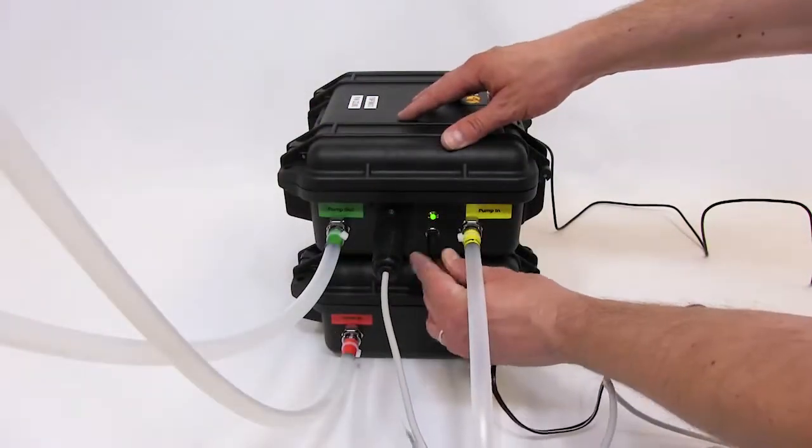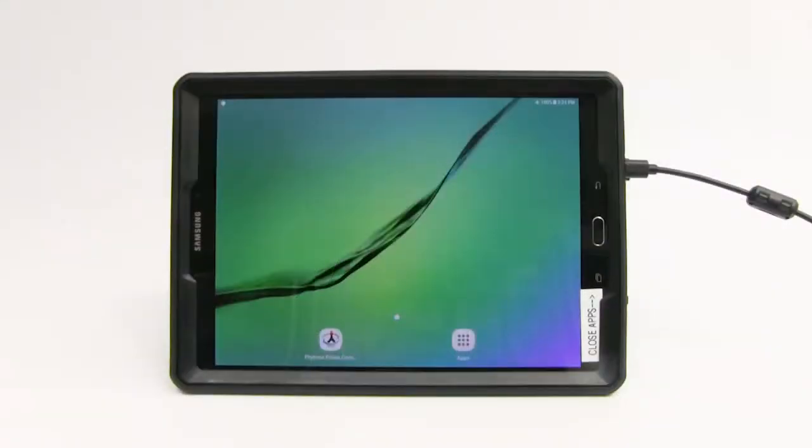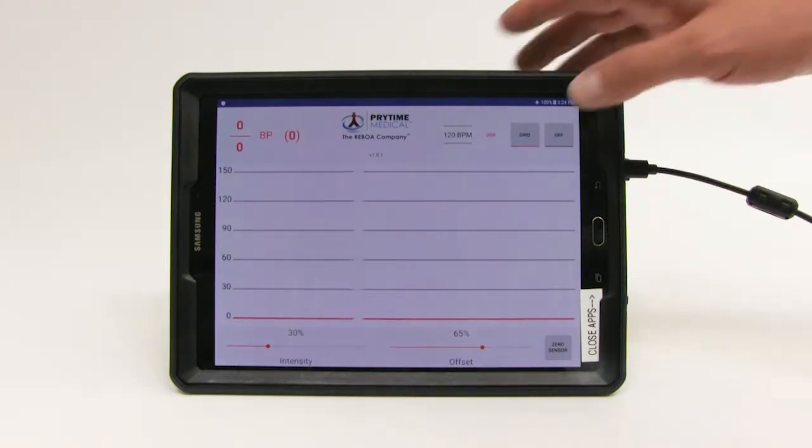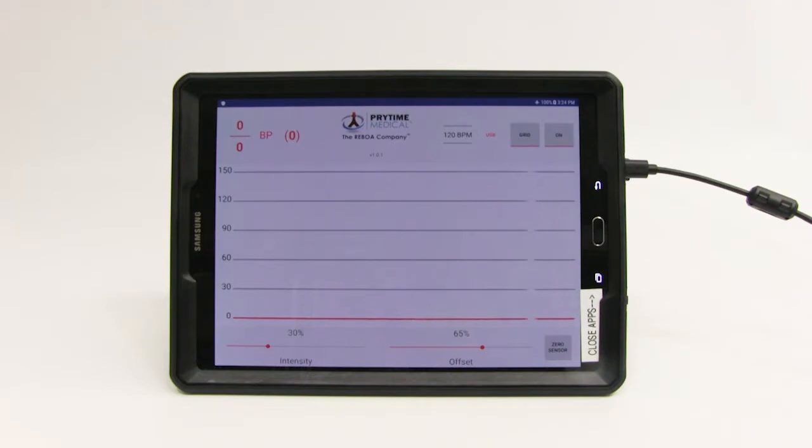Plug the power supply into the pump. The green light on the outside of the pump will light up and the application on the tablet will automatically launch. Once all potential leak points have been checked, activate the pump by pressing the on-off button at the top right corner of the application window.